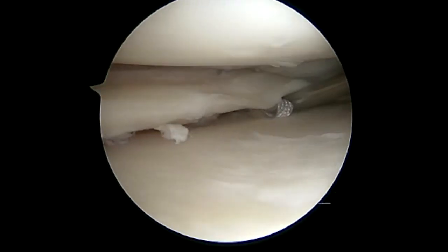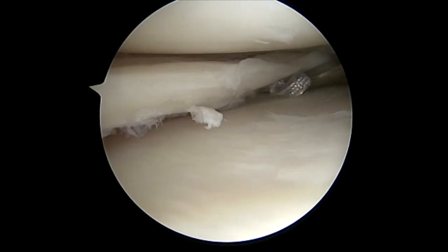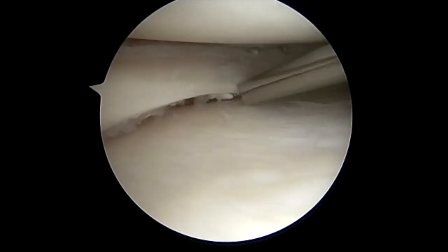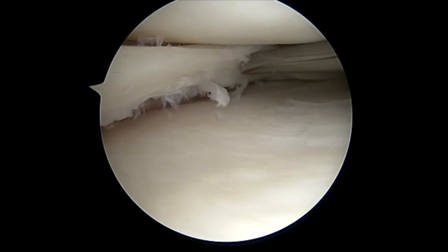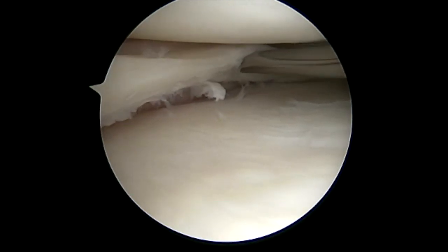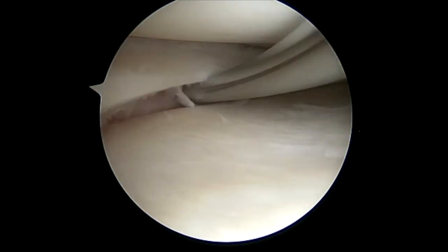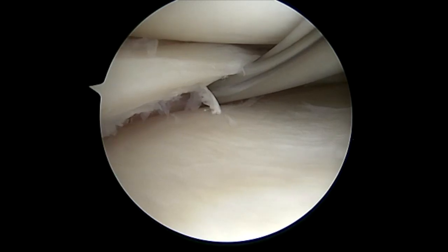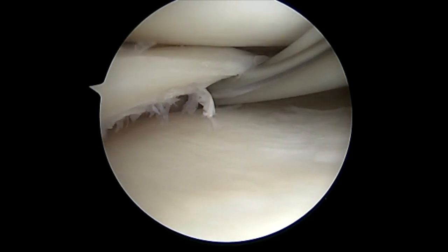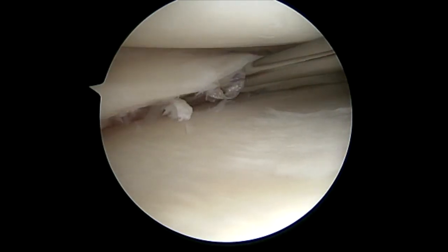All stitches are placed in a vertical mattress fashion to avoid pullout of the radial fibers of the meniscus. We place four above and four below, which enables the meniscus to sit in anatomic orientation and does not under or over reduce it. It's a single cannula — the needle is placed into the meniscus first. Once that needle is pulled out, we turn our attention to the lower surface and place the second needle, pulling the suture tape through the capsule.